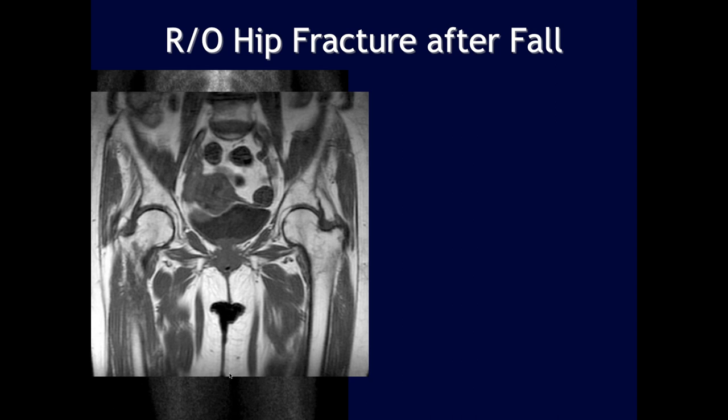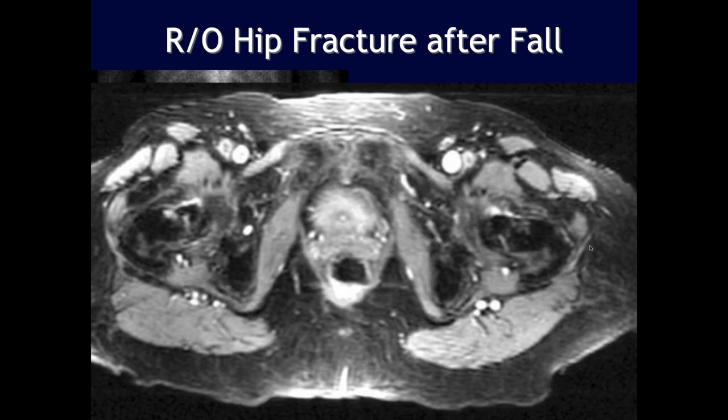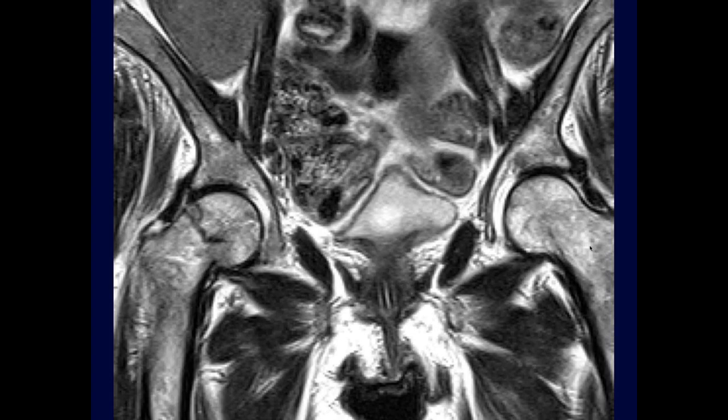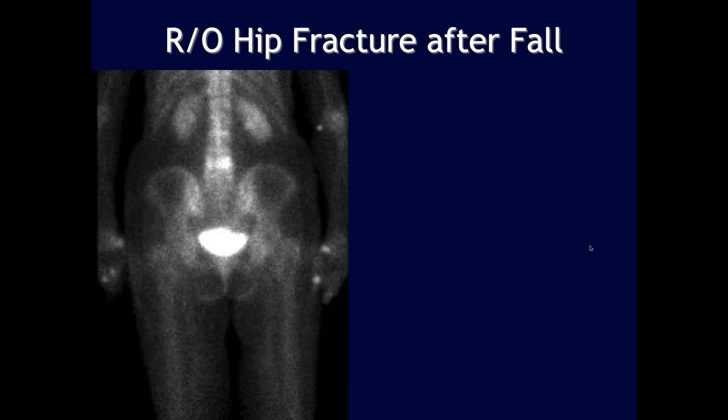And then, okay, the right femur, we're not getting some weird angle, right? That's pathology. It looks like an intertrochanteric fracture with edema. No, that's not an intertrochanteric fracture. That's a low, base of the neck fracture. Yeah, sorry, base. And it doesn't look like it's complete. And then there's a little bit of signal on the left that you'd circled as well. Can we go back to the bone scan? I don't really see it.